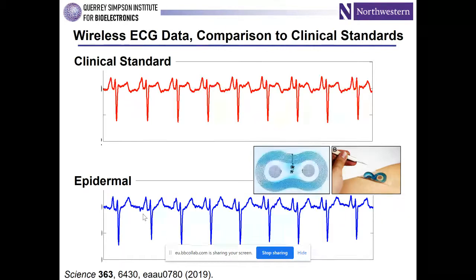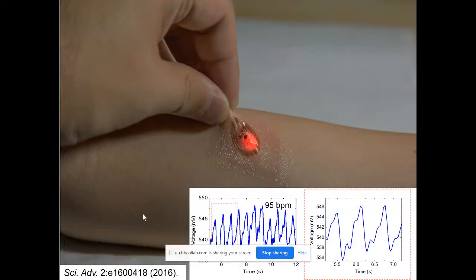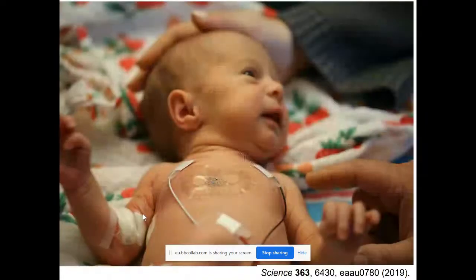But that's not all. If you want to do full vital signs and get rid of all the wires, and that's ultimately the goal here, you need another sensor that provides an optoelectronic rather than electronic interface to the body for measurements of blood oxygenation. And so this is another wireless battery-free skin interface platform. Instead of electrodes, in this case red and IR LEDs, lighting up out of phase in a pulsed operational mode, and then integrated in the same platform is a photodetector that's measuring backscattered light at those two wavelengths and transmitting continuously the readings to yield what is essentially a photoplethysmography trace. And so you can get from this then SpO2. And with those two devices, you reproduce everything that's done clinically in even the most advanced neonatal intensive care units like those that we have here at Lurie Children's Hospital.